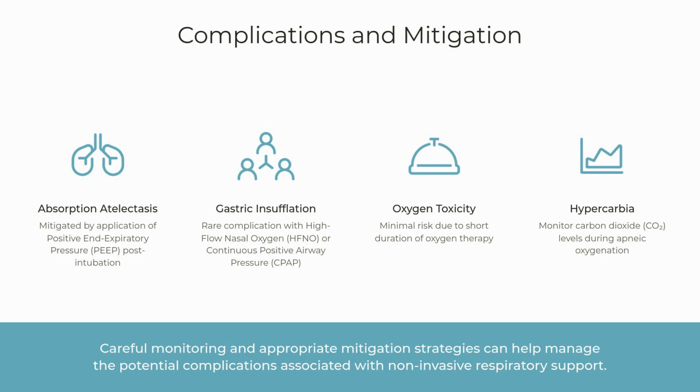Complications and mitigation. While preoxygenation and apneic oxygenation are generally safe, there are potential complications. Absorption atelectasis occurs when oxygen replaces nitrogen and is absorbed faster than it's replaced, collapsing alveoli. This can be prevented with positive end expiratory pressure, or PEEP, or recruitment maneuvers after intubation.